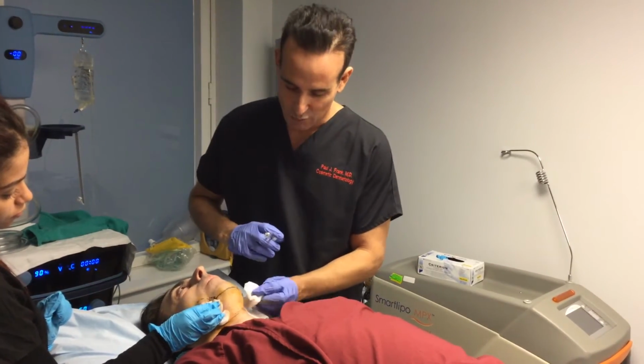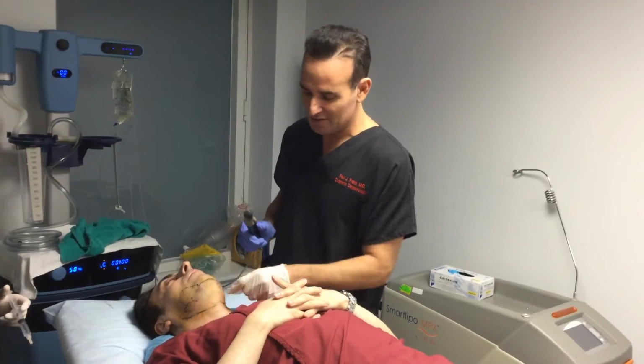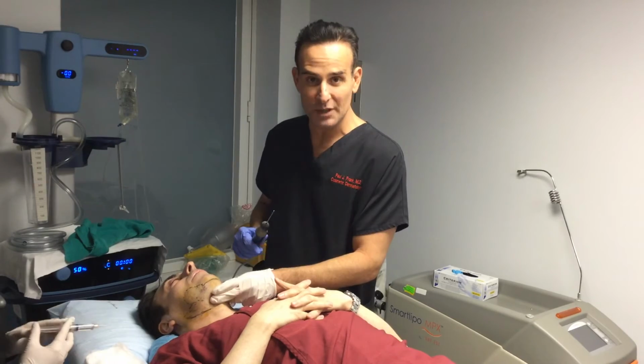And it shouldn't take more than an hour total. So we'll see you back when he's ready to go. He's totally anesthetized. Again, the area is swollen up because of the local anesthesia.